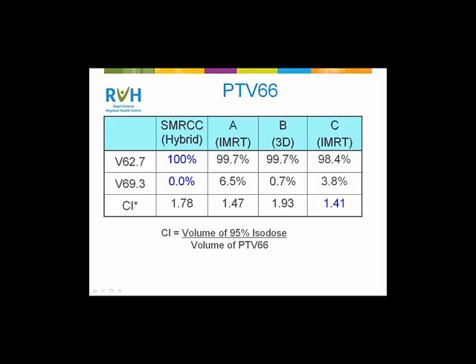And if we take a look at the 3D conformal plan from center B and compare it to the hybrid, it's really interesting. So they had an ant and a post field, and in the base fields we have an ant and a post field, right? And then they added a posterior oblique field at this angle here, and the optimization saw that as it got up past the cord, this was a favorable angle to push dose through, so it did the same thing. And then the GTV of the tumor and the nodes lined up well in this angle, so the planner decided this would be a good choice to push dose through here. And the optimization saw the same thing. As it comes up through the avoidance sector, it starts sending dose through that angle. So it's like a planner, and that's exactly what I wanted it to do.